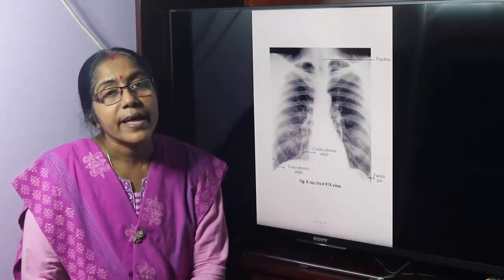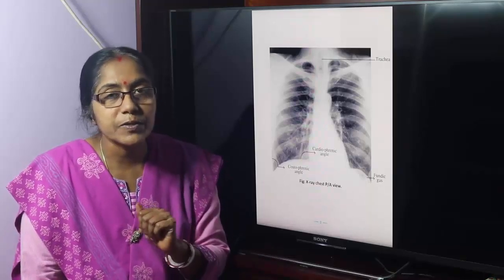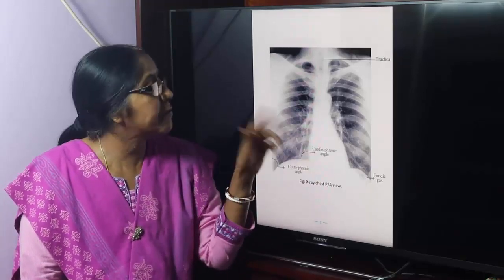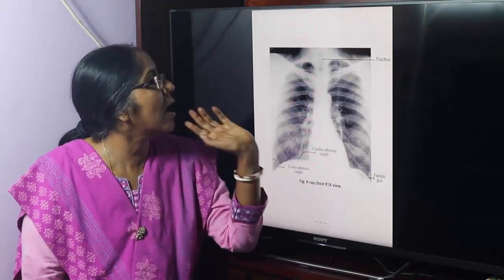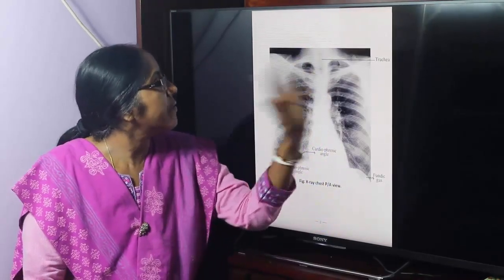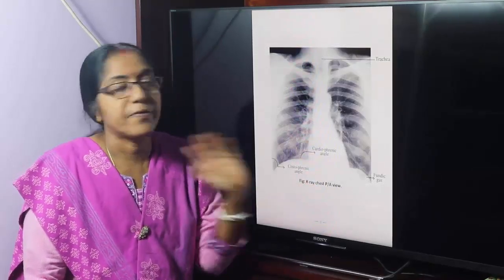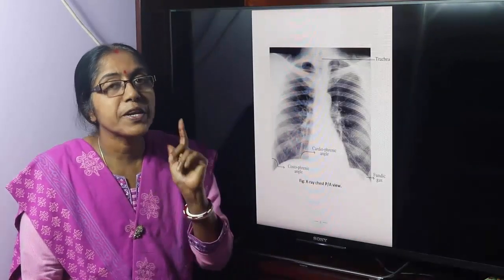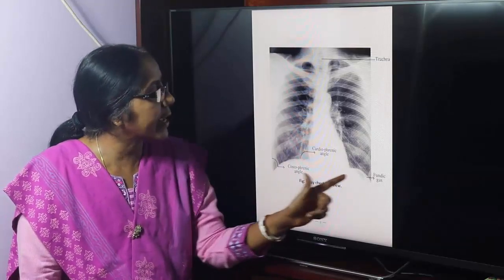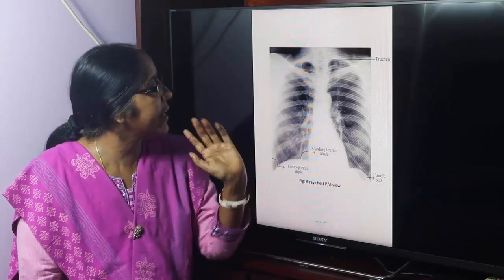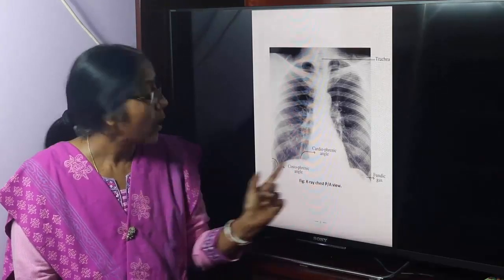This is all about the x-ray chest. The x-ray chest PA view shows the shadows of the heart, lungs, trachea, clavicle, ribs, and the diaphragm. You can see the costophrenic angle and the cardiophrenic angle. This is the fundic gas. This is the right dome of the diaphragm and this is the left dome of the diaphragm.